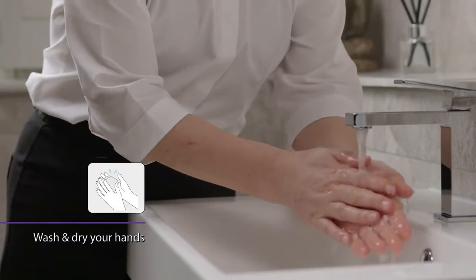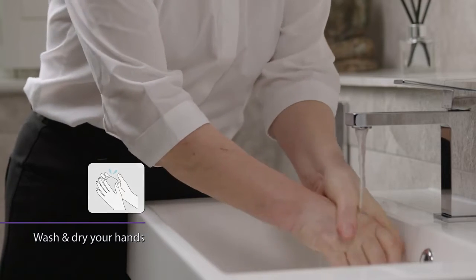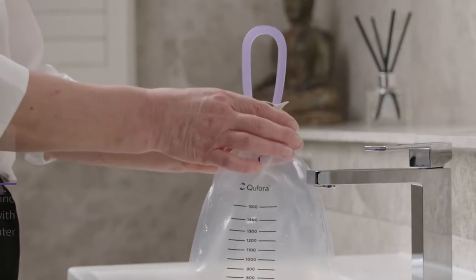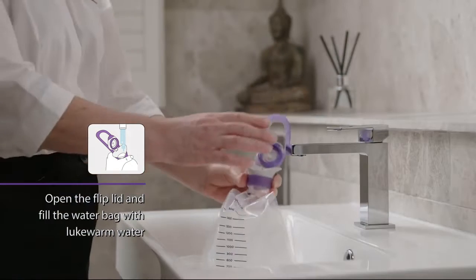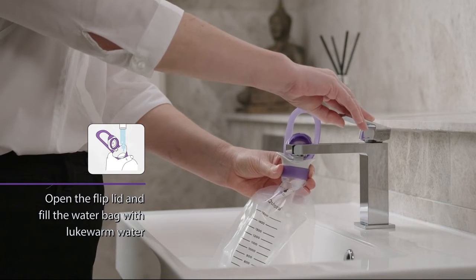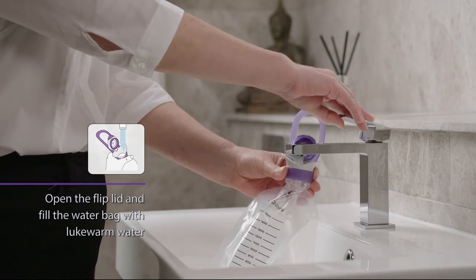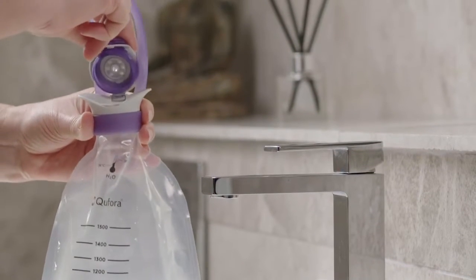Start by washing and drying your hands. Open the flip lid and fill the water bag with lukewarm water. Your healthcare professional will advise you on how much water you should use to irrigate your bowel. Allow an extra 300 mils to fill the system with water.